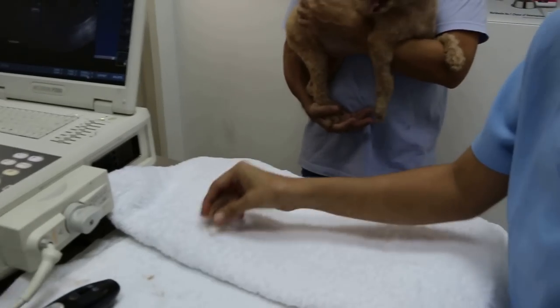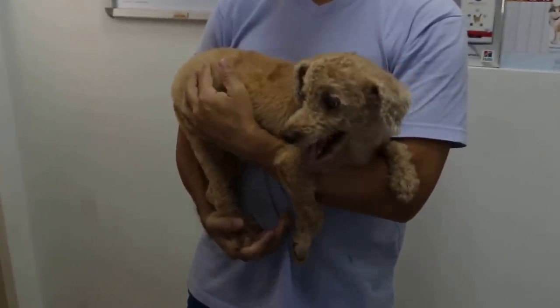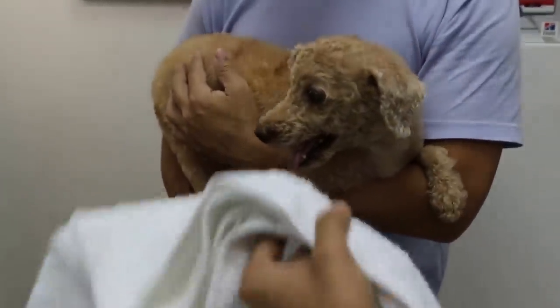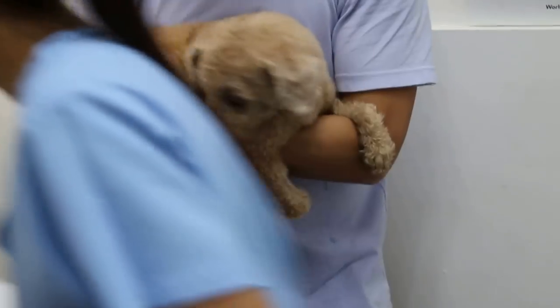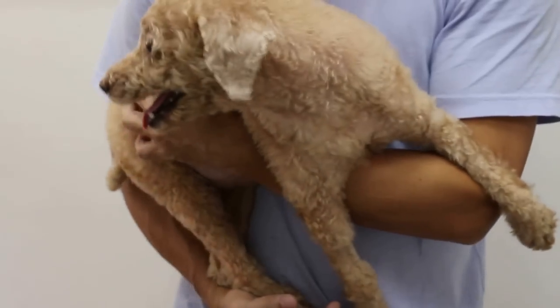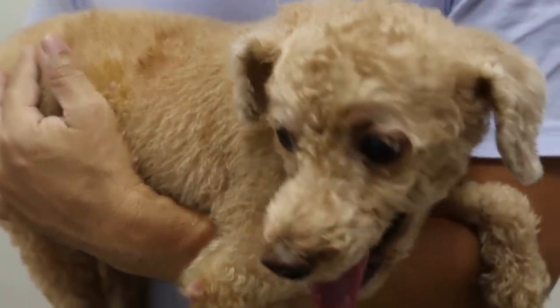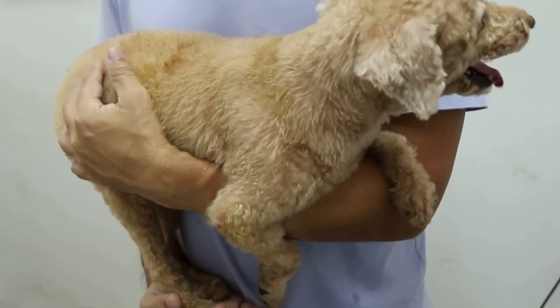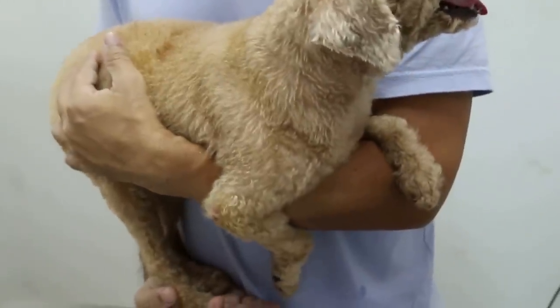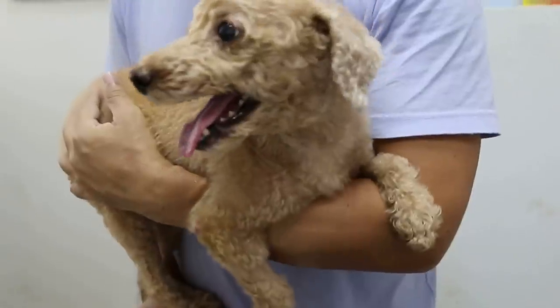Yeah, that's part of the syndrome of adrenal gland. You think it's a tumor? Both have nodules. It can be PD, but the test will tell. At least he's happy that there's no liver tumours. No abdominal tumours. Sometimes they have these lumps inside the abdomen. And that explains the hunger. These steroid hormones cause them to be hungry and thirsty. This is body produced steroid hormones.